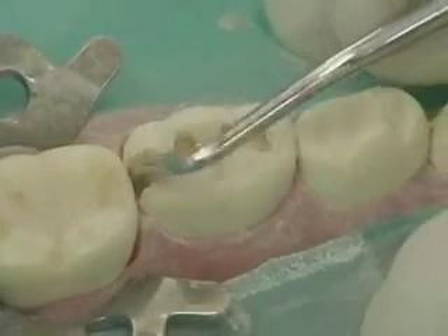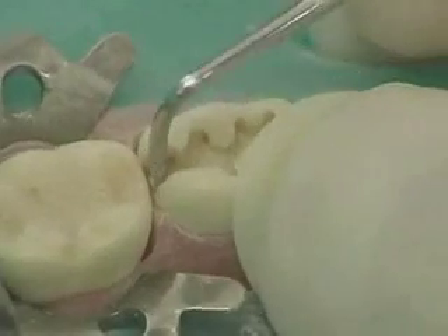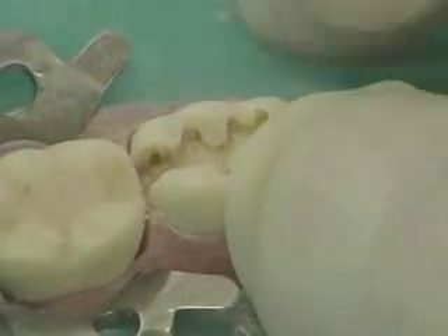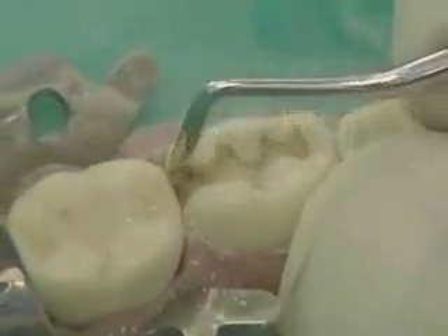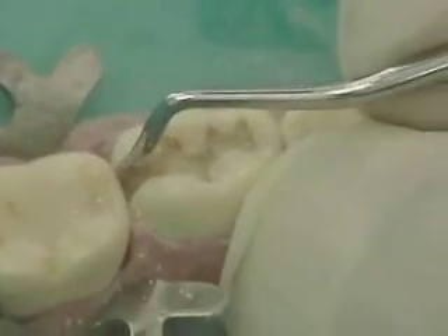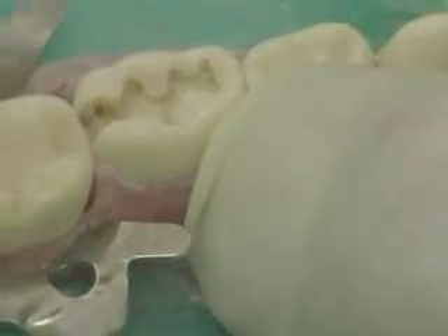Using an 11 series spoon excavator, plane the gingival wall and the buccal and lingual walls. The spoon excavator can be used over the entire cavosurface margin to remove any undermined enamel and to create a concentric axial wall with an axiopulpal bevel. The finished preparation should have no sharp angles at the cavosurface margin. The outline form should contain gentle arcs and curves.